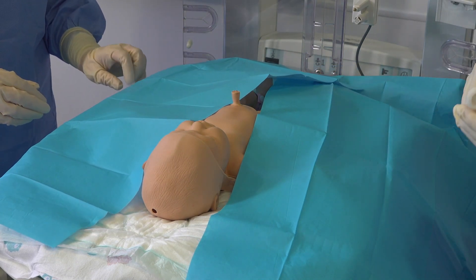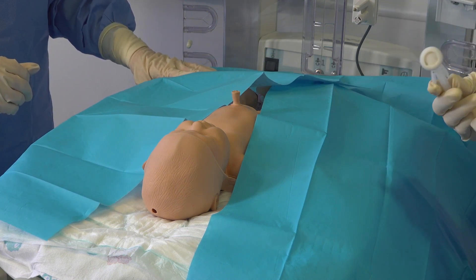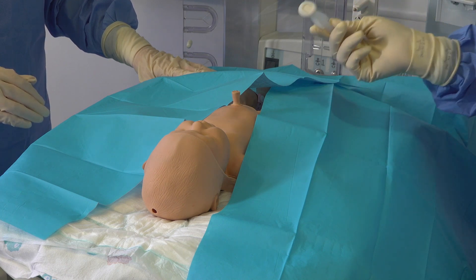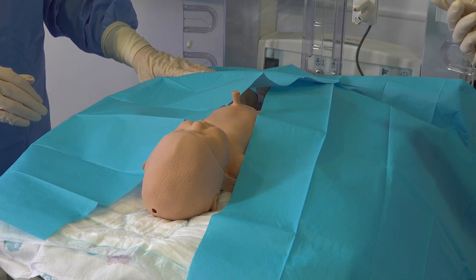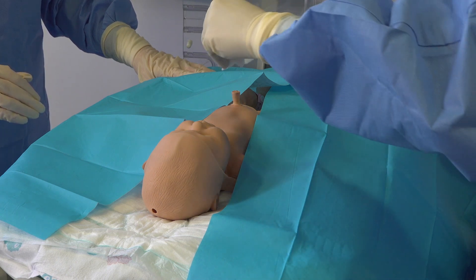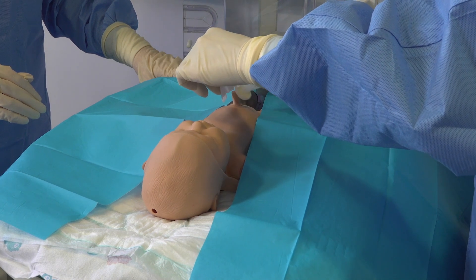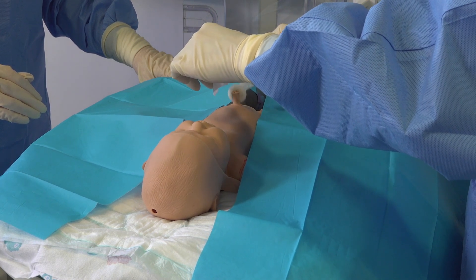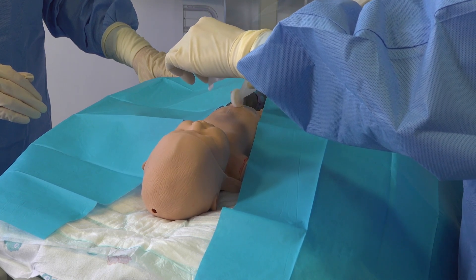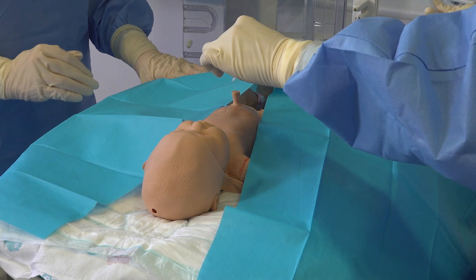Next we're going to clean the surrounding areas. As this baby is above 26 weeks we're going to use our chloroprep. Most babies when we're inserting these have cord ties on, and if your baby has a cord tie on I use some sterile gauze to hold this whilst cleaning the area. Ensure all of the cord, cord tie and surrounding abdomen is clean, allowing this to dry for 30 seconds.